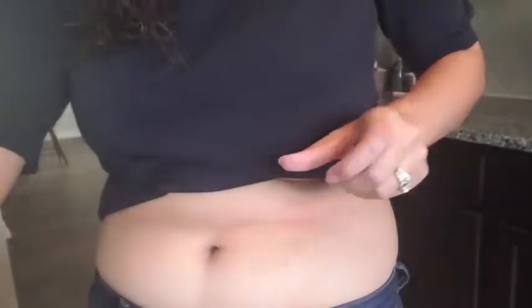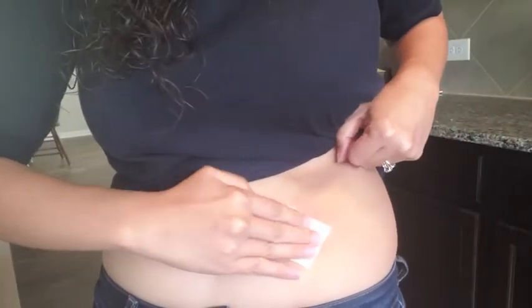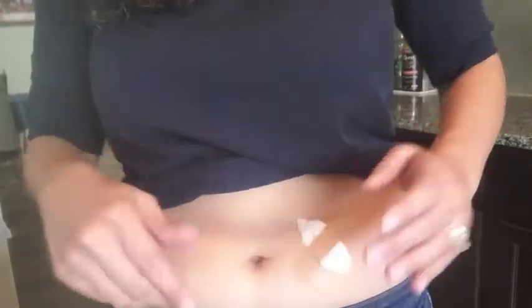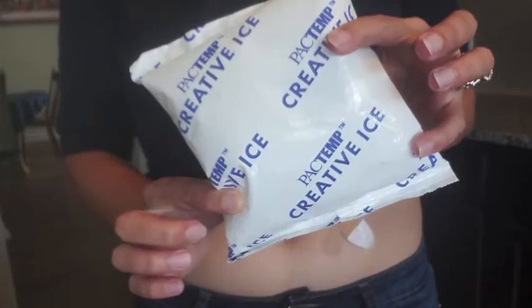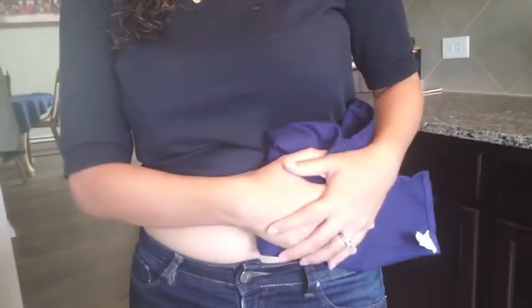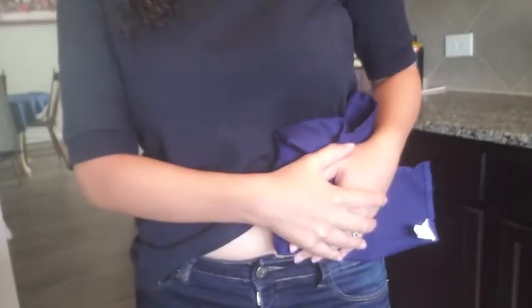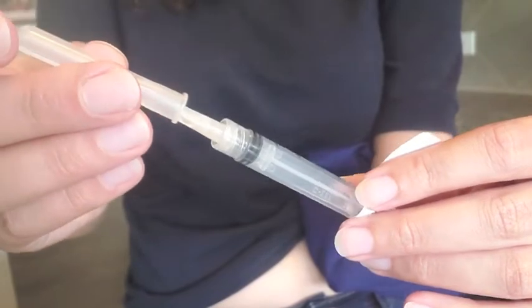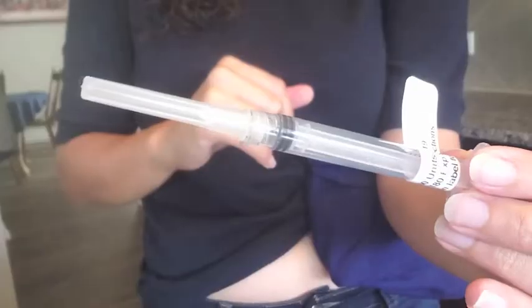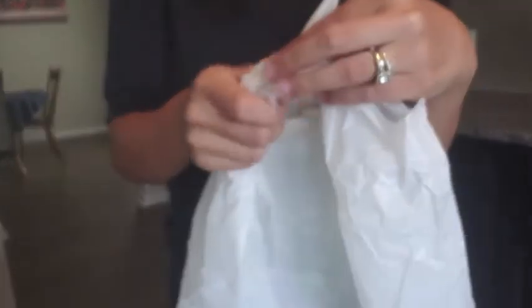Sorry, this isn't the best angle — I was pretty nervous when I filmed it. But there you go. Place your gauze over it and apply a band-aid. Afterwards, I got an ice pack and wrapped it in a dinner napkin. It's not really painful, just a little sore. Make sure to dispose of your needle properly — put the cap back on, put it in a bag, and bring it to the doctor's office to dispose of safely.